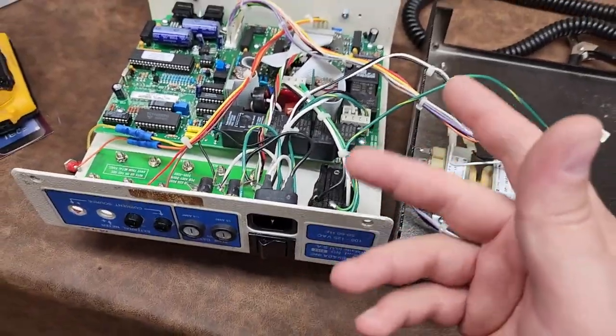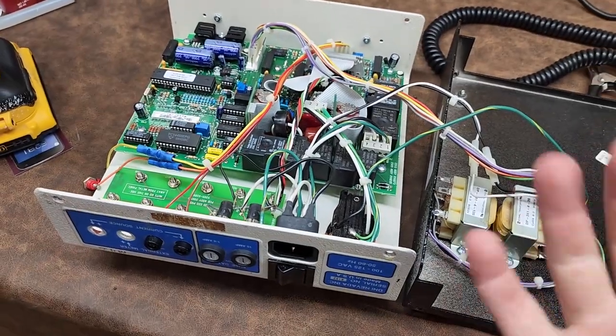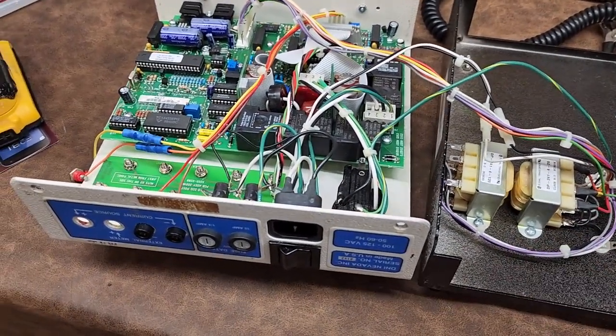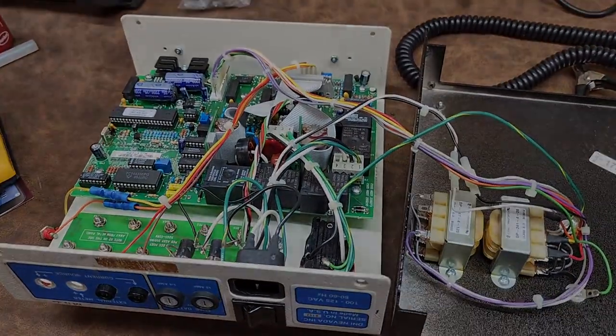After you do anything to this device whatsoever, you obviously have to ship it out and get it recertified. Even if it was just fixing a terminal or something like that, you have to go and get it recertified. And that's what I'm going to do — fix those, fix that, and I'll be right back.